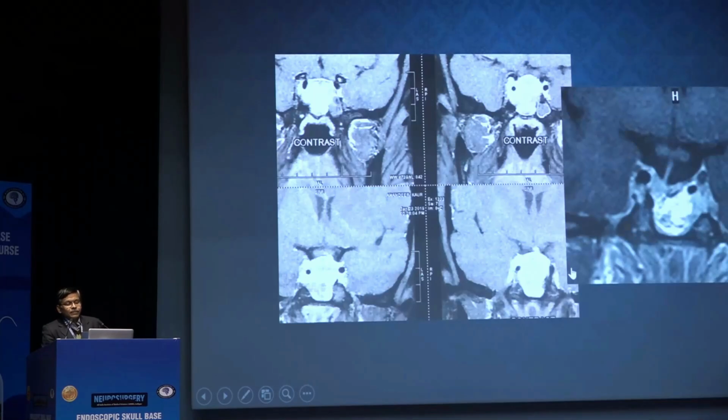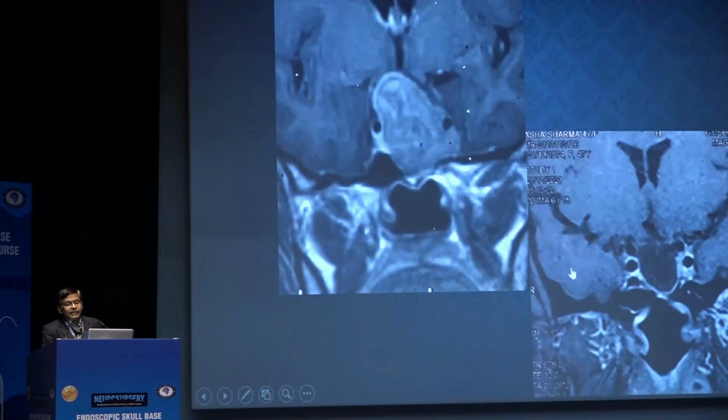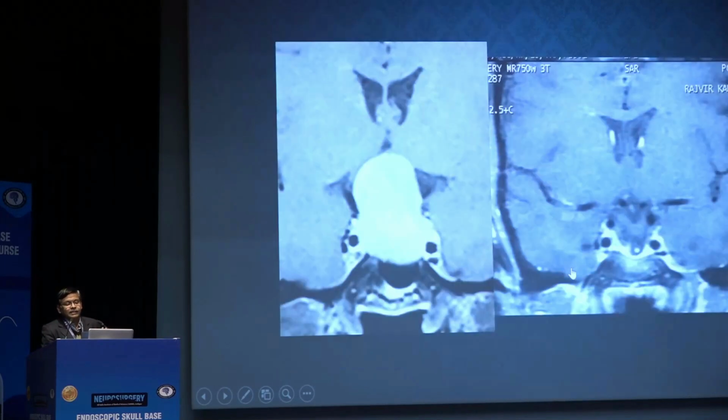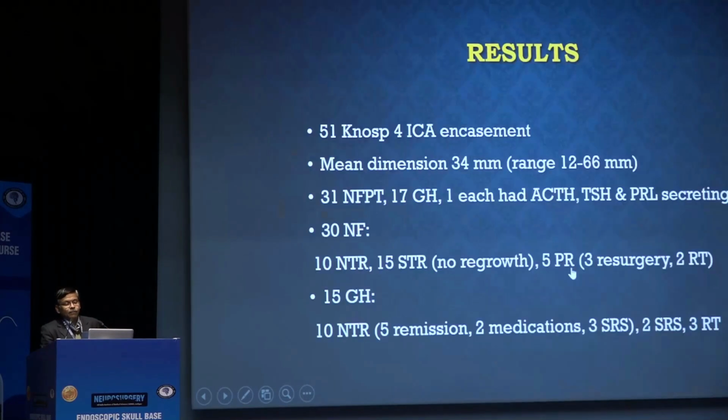Most of the time, if the tumor consistency is favorable, you can have a good outcome. So evaluation with CT angiography and careful management become very vital. And anytime when the consistency is very firm, fibrous, or when there is calcification, we routinely don't do a plain CT. But I have learned over these years that if a plain CT shows calcification, which is very rare in pituitary tumors, then you can be a bit conservative rather than being aggressive, because a calcified tumor can increase the complications.